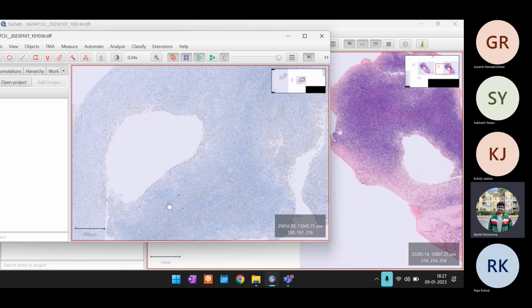After we have the RS cells, then we'll use data augmentation. Sorry, not data augmentation, but targeted subset selection, where RS cells are the target, and then we'll use FL to remove RS cells from the environment, and then do clustering in the microenvironment.